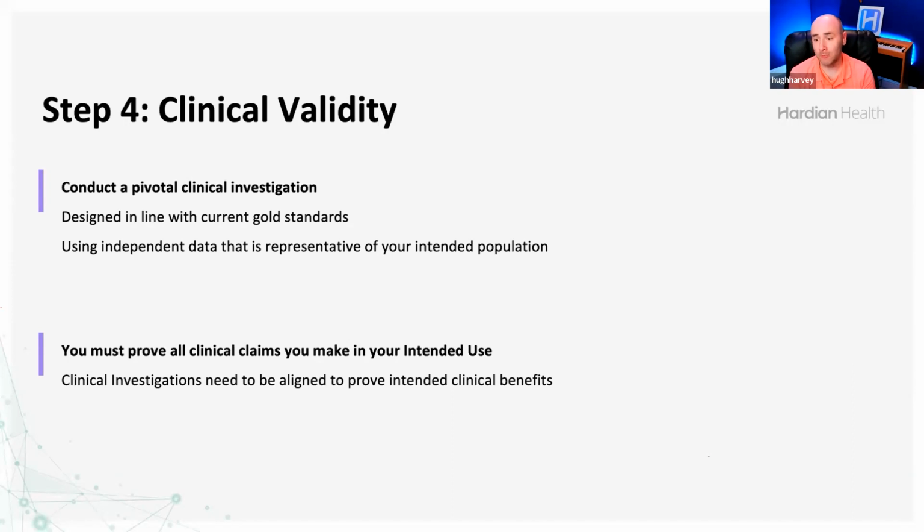Ideally, if there has been an adverse event reported in news, someone will report it on a regulatory database as well. Just to add to that, on the Gov UK website, there are also field safety notices for drugs and devices. Although it's not very well populated, I think that's also a good place to look for possible adverse events that have happened.